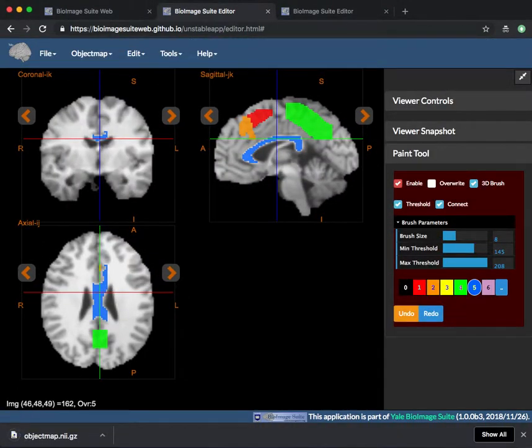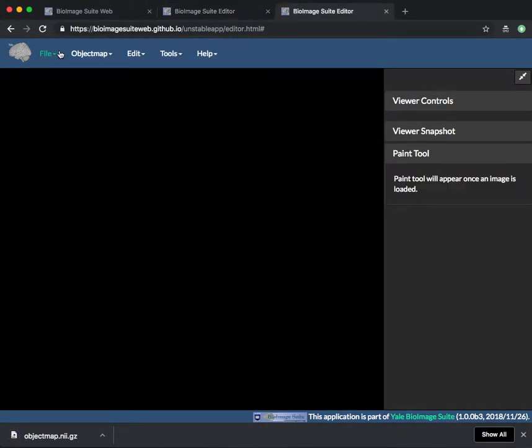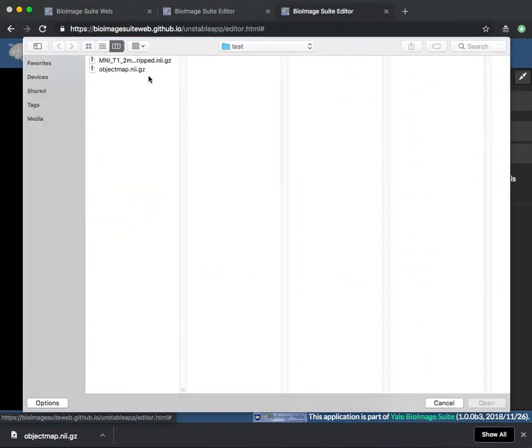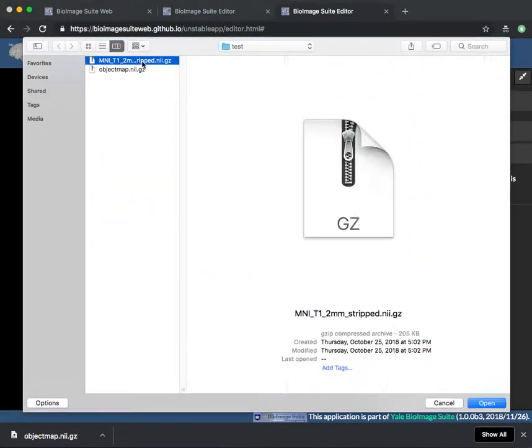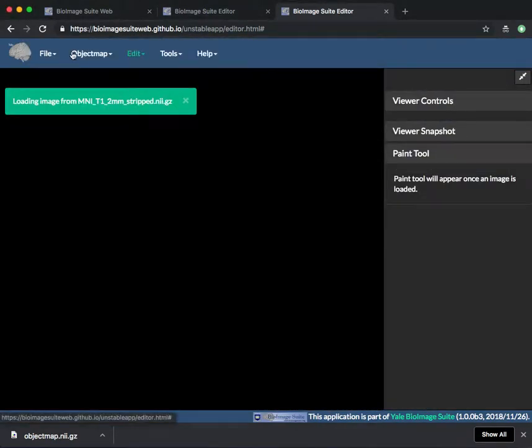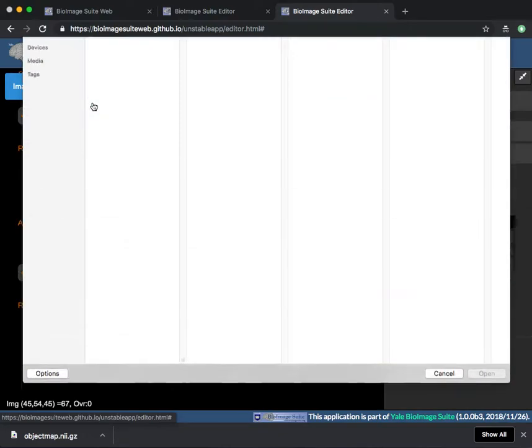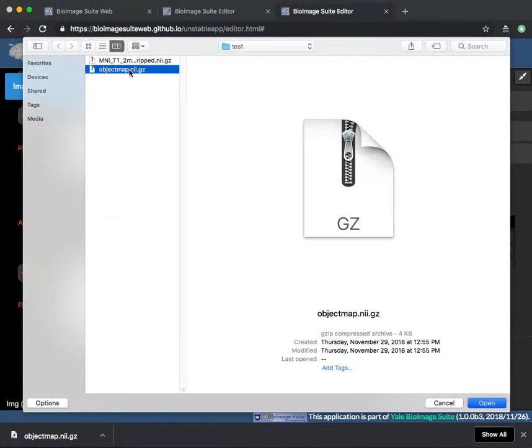You can then come back at a later time and reload your anatomical image under file load and your object map under object map load object map.